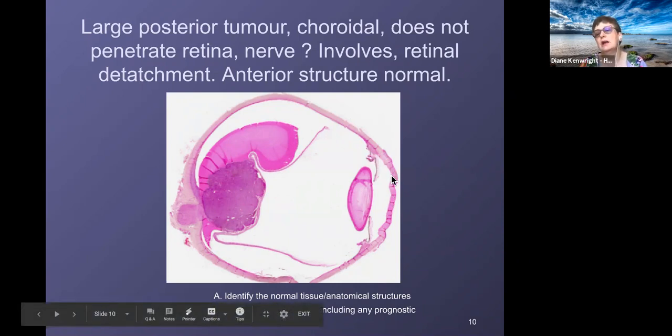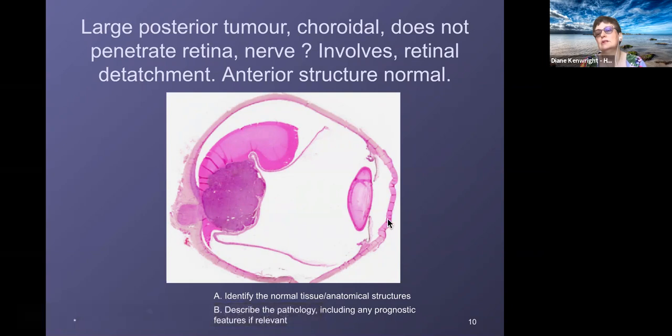But this has just become wrinkled during the cutting process. You can see the wrinkles. One of the hard things to do is to identify what's artifact and what's not artifact in globes. In the exam they will choose nice examples, but as we go through, we'll point out things that are just faults of the processing.